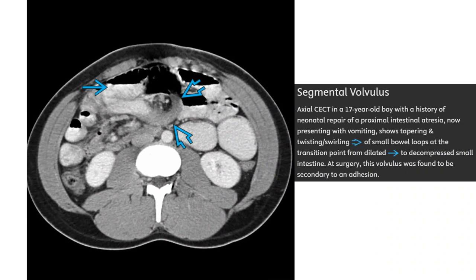Contrast-enhanced CT in a 17-year-old boy with a history of neonatal repair of a proximal intestinal atresia, now presenting with vomiting, shows tapering and twisting of the small bowel loop at the transition point with dilated proximal and decompressed distal small intestine. At surgery, this volvulus was found to be secondary to an adhesion.